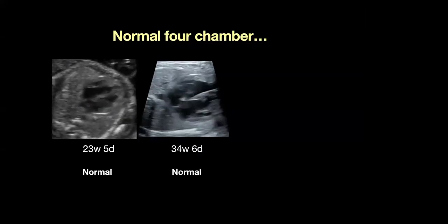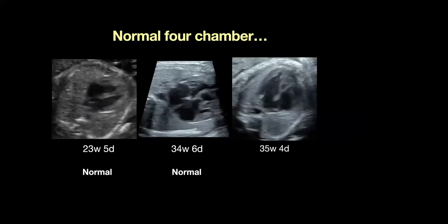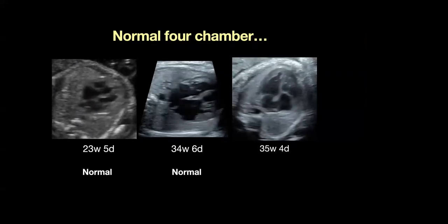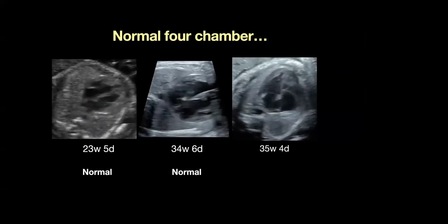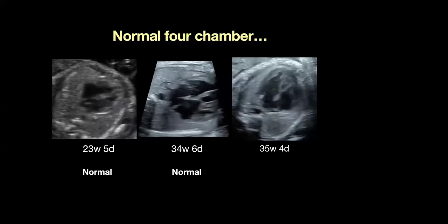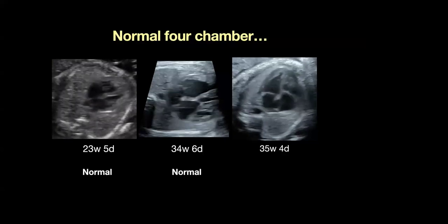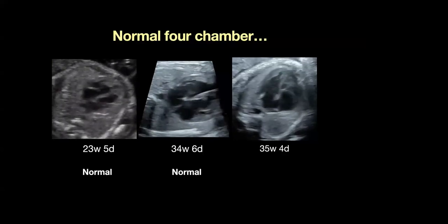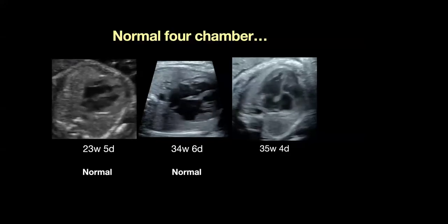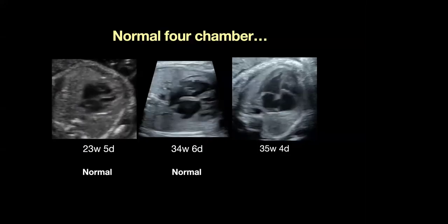Patient did come back to us again through the labor and delivery. And of course, typical standard procedures. Anytime we have someone that comes through there, the sonographer would take a look at the fluid filled structures, kind of ensuring and also documenting the heart structures that we could. And here we're able to get the view. And this is actually the same patient. So this is 35 weeks and 4 days. And I want you guys to tell me, what is it that you guys actually see here?